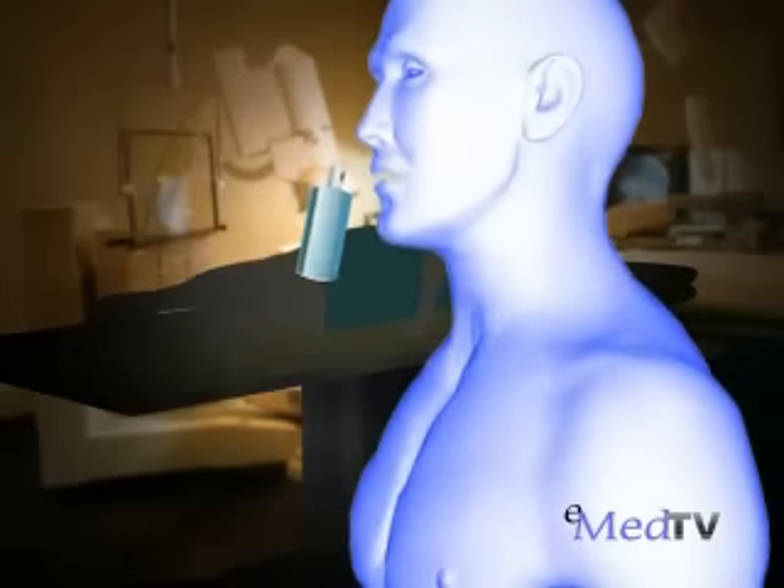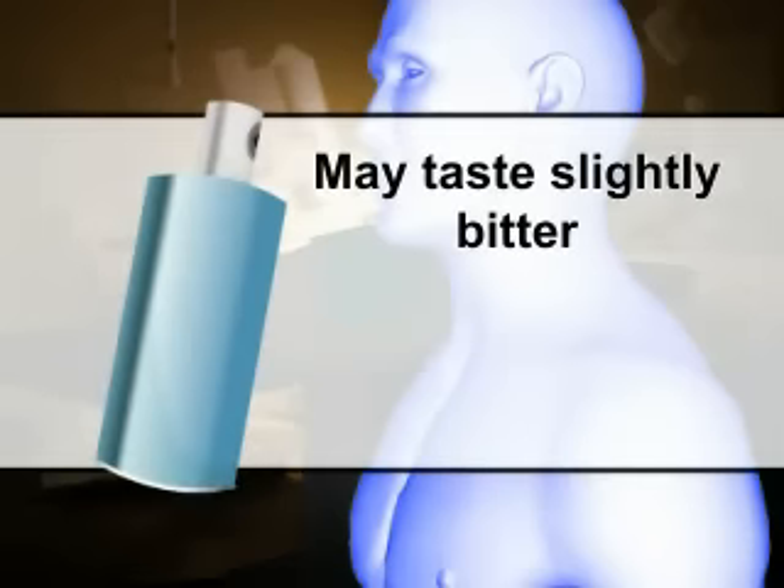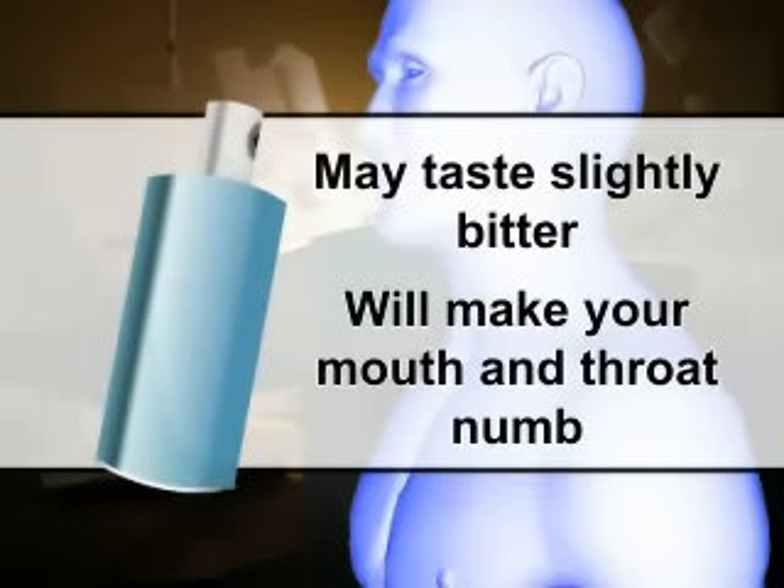To make this examination more comfortable, your nurse will spray a numbing medication into the back of your throat, or you may gargle with it. This may taste slightly bitter and will make your mouth and throat numb for approximately 30 minutes.